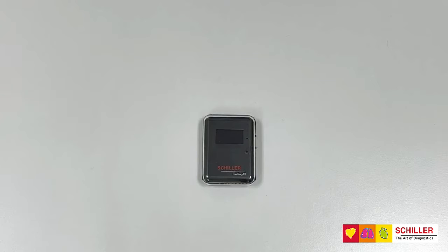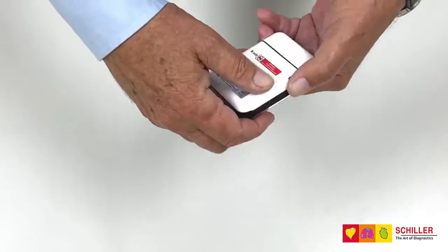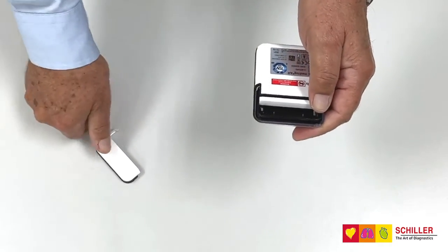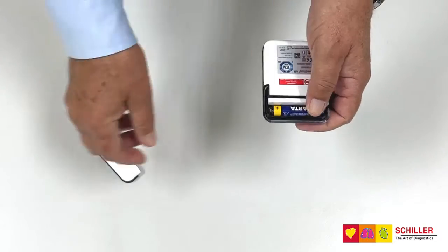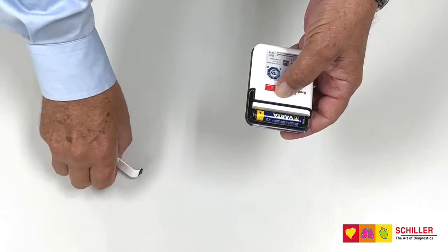Medilog AR Holter Recording. Starting a recorder through the recorder. The first thing you need to do is open the back cover and insert the battery. Check that the SD card is inserted on the side of the recorder.